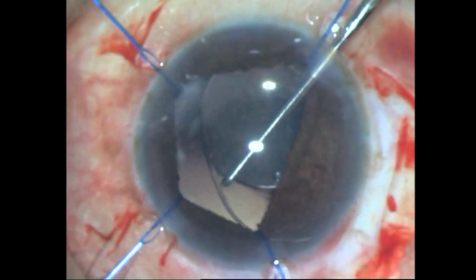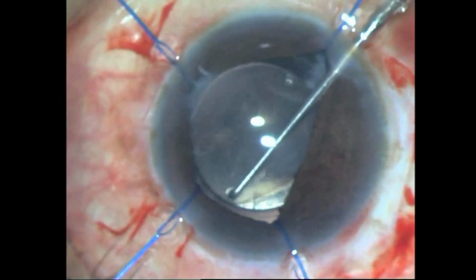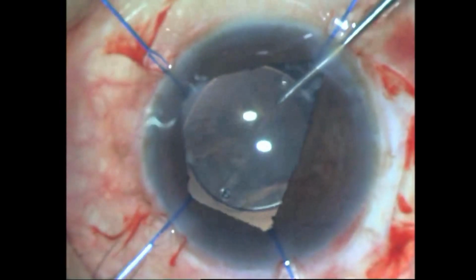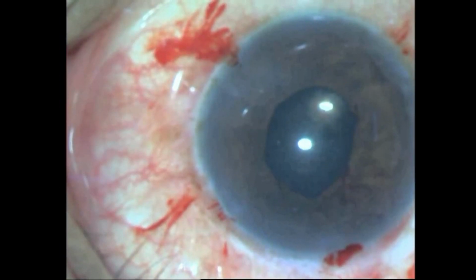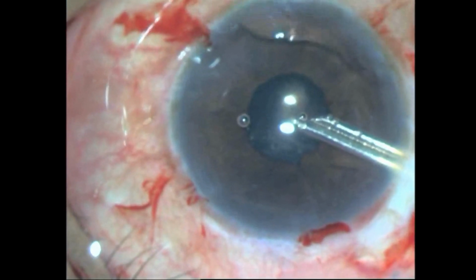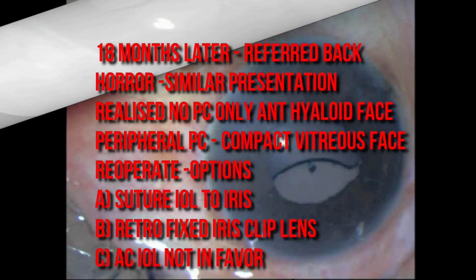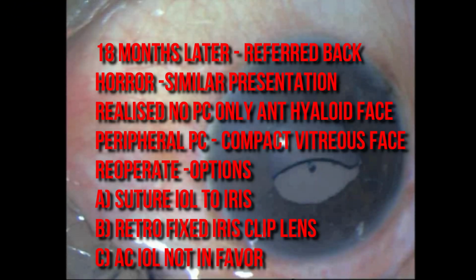Then removed the iris hooks, removed the OVD, sent him home very happy with a vision of 6/9 with correction. He was followed up by the referring doctor and everything was well till 18 months later. He was referred back, and to my horror he presented similarly. Again the IOL had dislocated and the haptic was rubbing against the cornea, and this time I realized my mistake.